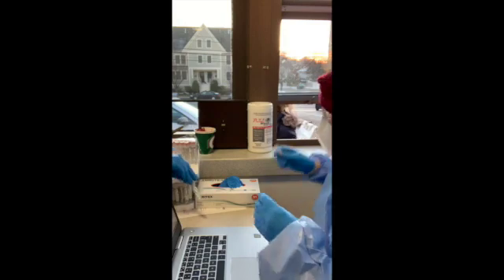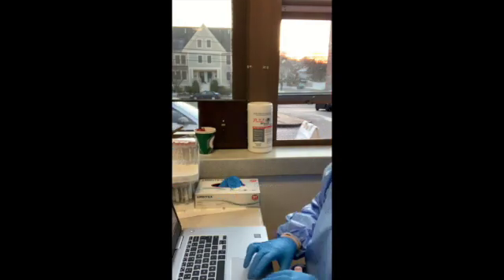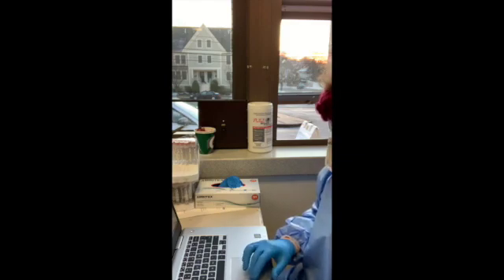We handle everything except for the swab, so the only thing that they are touching with their hands is the swab, and it goes directly into the tube. They're not handling the tube, they're not handling the cap. They blow their nose, they hand sanitize, they swab. We do the rest, we print the label, and then we store it.